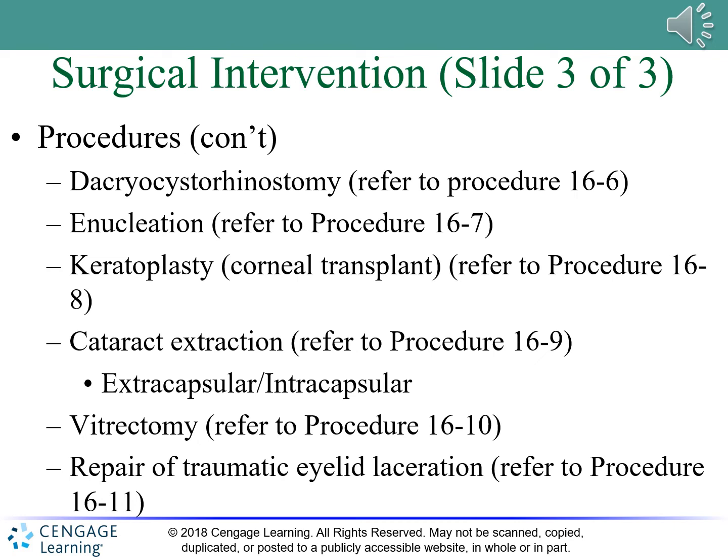All right, on 614, where it says Pearl of Wisdom, make sure that before you do any kind of keratoplasty, you confirm that the donor cornea has arrived. Make sure it is either in the facility or better yet in your room before you start the procedure. And really with any implants from a cadaver, but more so with this one.